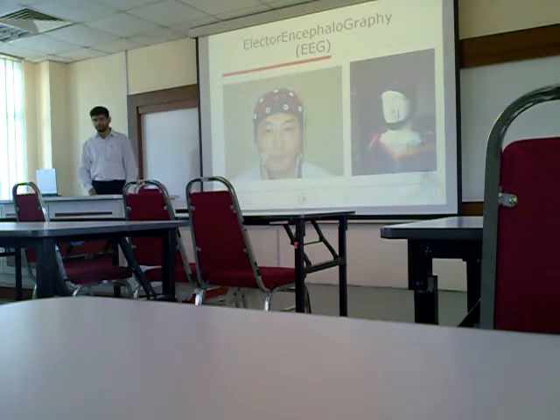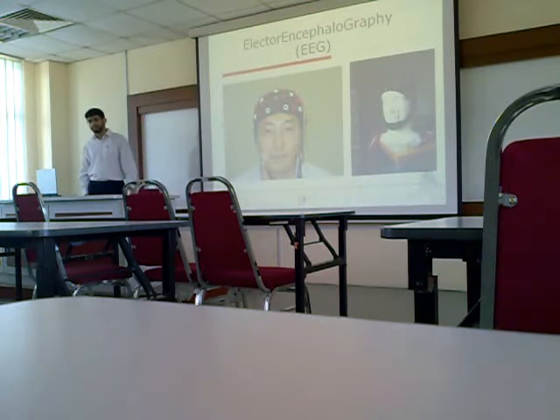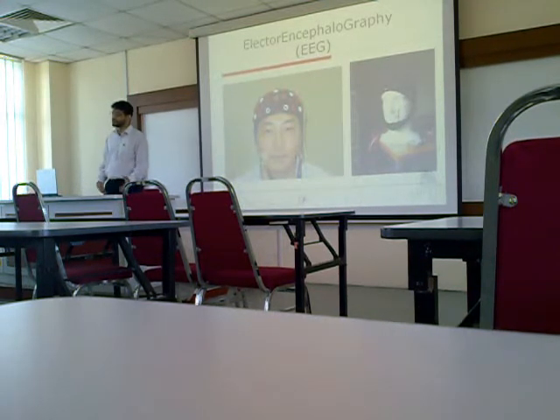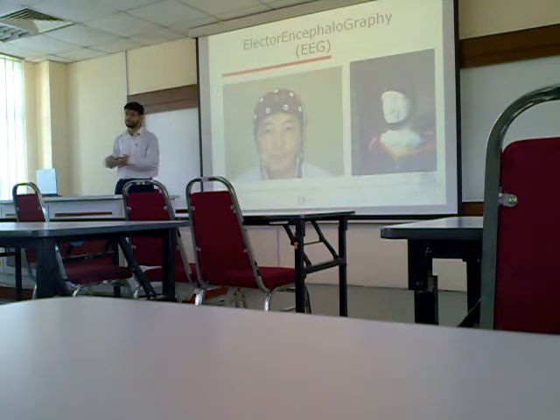The most useful technique for our projects here in engineering is the electroencephalograph, because it is very cheap and portable. But it has its own drawbacks: the spatial resolution of this technique is relatively low, although the temporal resolution is high. There is also some signal distortion because of the underlying tissue and bones, and the relatively far away signal sources, so there will be some mixing with the nearby fibers.